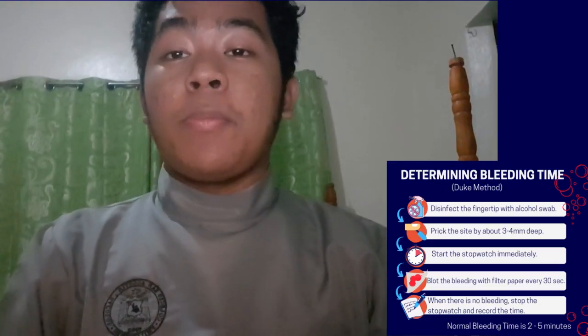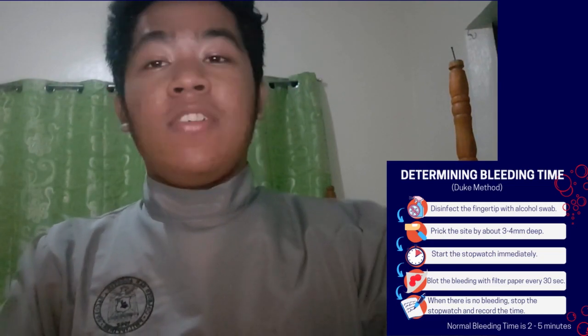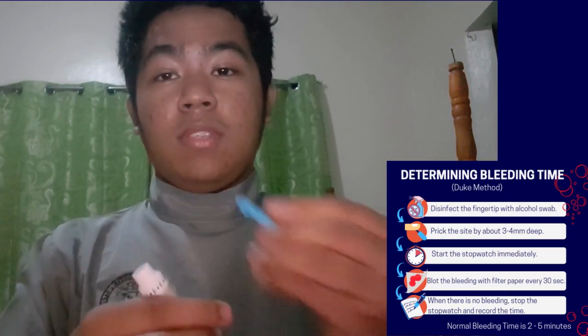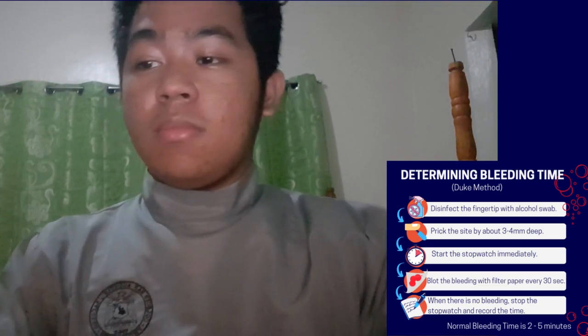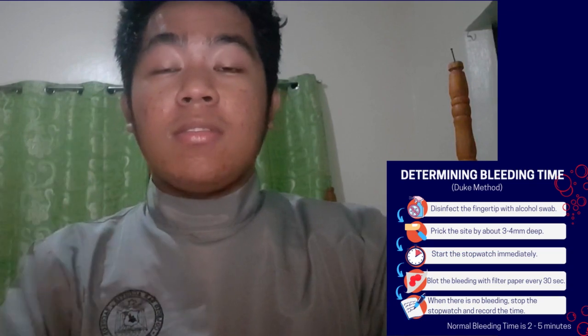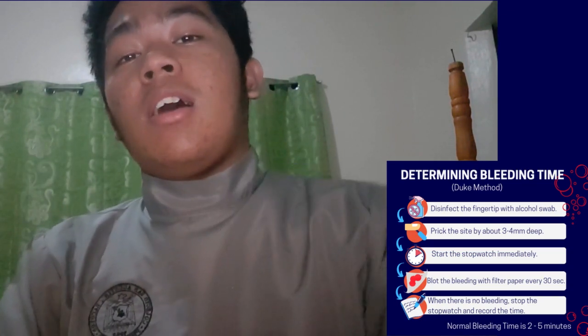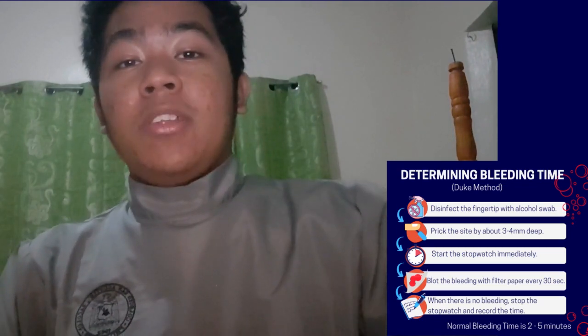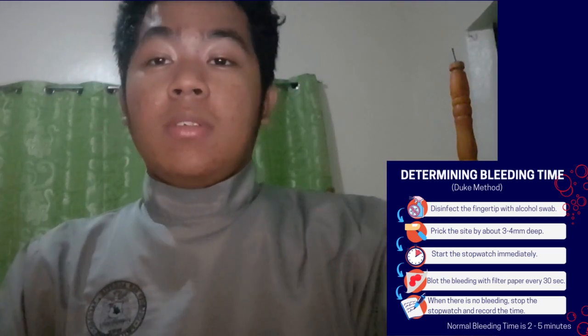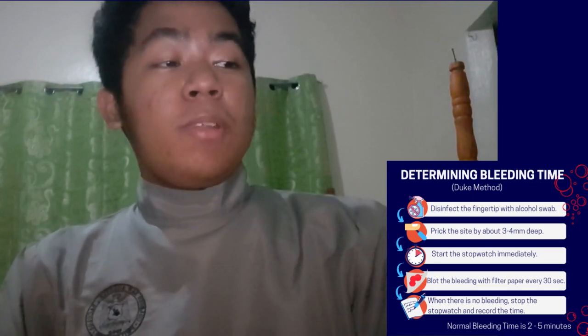Today I will demonstrate the Duke's method of determining bleeding time, and you must watch closely because after the demonstration, each pair will perform the Duke's method. One partner will be the patient while the other performs the procedure. First, let's prepare our materials: we have our lancet and its needle, cotton balls, alcohol, and paper to catch the bleeding. Let's wear our complete PPE.